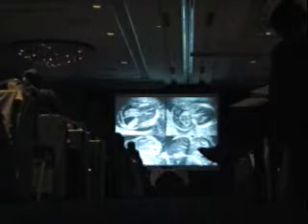Here's another one that's just as big. Now, here is the head. Now, you can see why these are associated with microcephaly, because the head is very small because most of the brain is out here. And this is a longitudinal view done transvaginally, actually showing you the texture of the brain that's outside. This is the skull, and this is the large opening back here in the posterior aspect, letting all this brain come out.